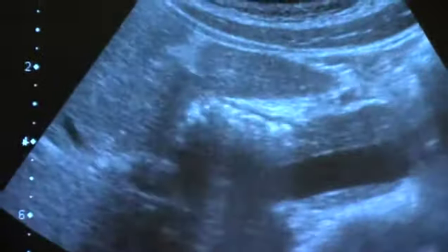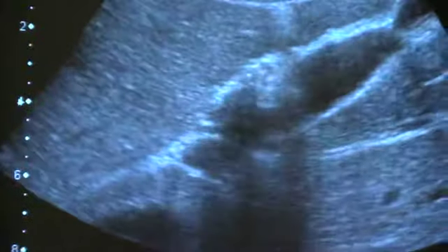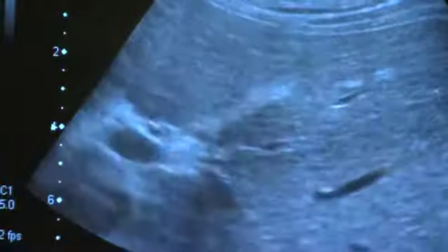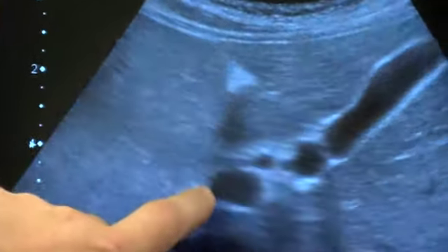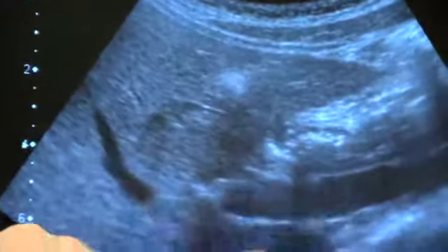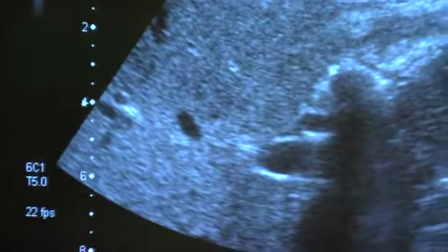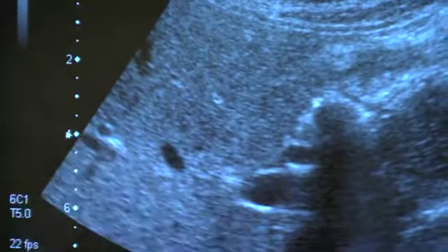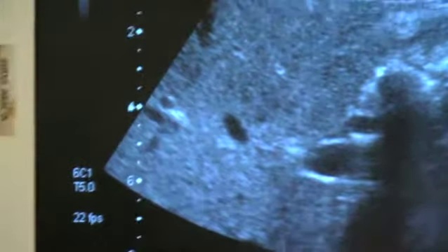So let me show you guys that again. I'll try to freeze it up for you. Okay. So take a deep breath and hold it. Try to keep your pictures in the center. Portal vein, 90 degrees. This is portal vein in the long axis view, and that's going to be the common bile duct just anterior to the portal vein and running completely parallel. If I was to put flow on that, there would be no flow. And it's usually about a third to 1/2 the diameter of the portal vein, which is normal.